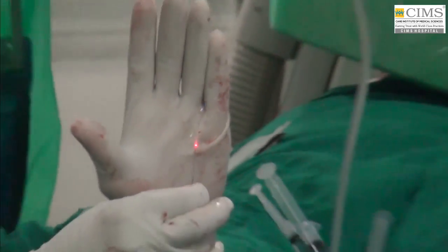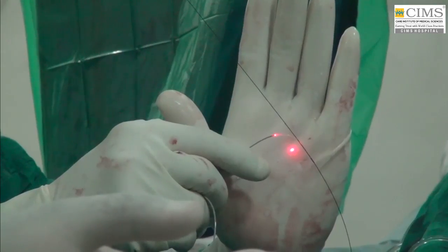Dr. Keyur, one more question. Why didn't you prefer IVUS here? Why are you preferring OCT only? Do you do more of IVUS or OCTs in your intervention cases?